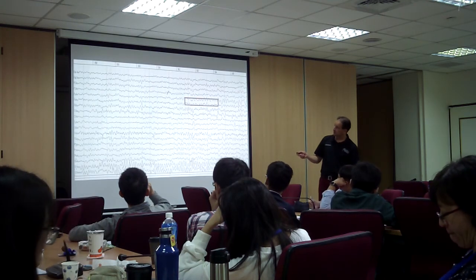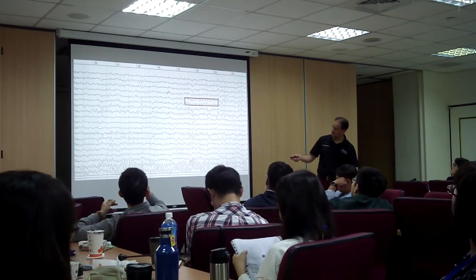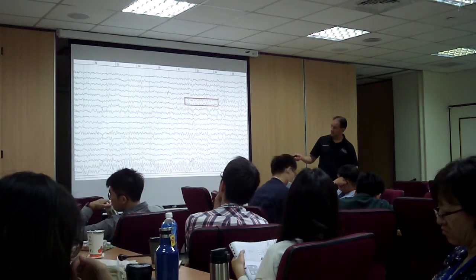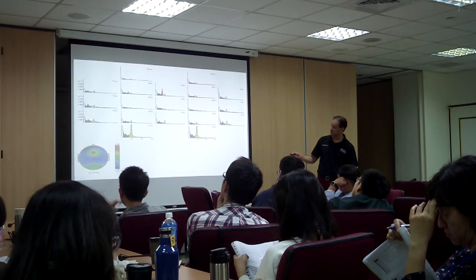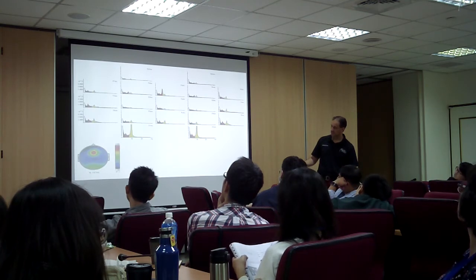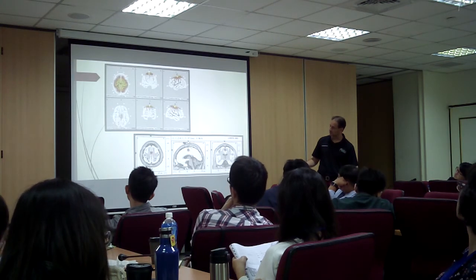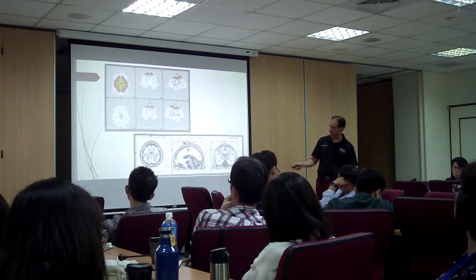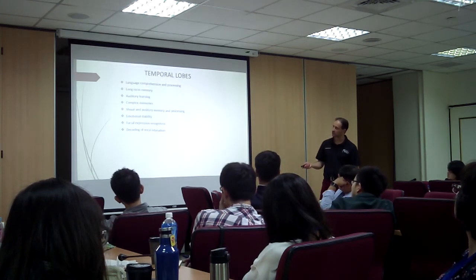And here's a pattern for the anterior cingulate cortex. It's a healthy, active, overactive anterior cingulate cortex, and this is what it looks like. See it right there? There's your theta and your alpha, and that's what the topography looks like. Overactive limbic system. That's what LORETA would look like for this case. And there's sLORETA, and that's just LORETA. The software can be really accurate and it can help us predict.